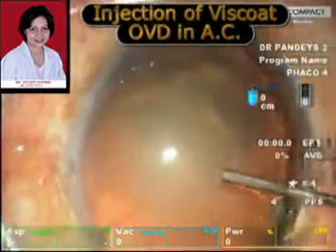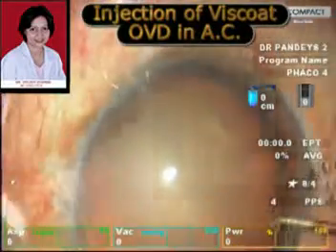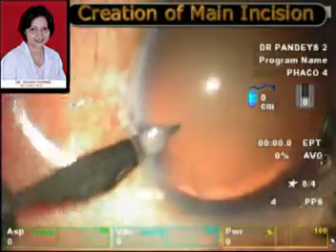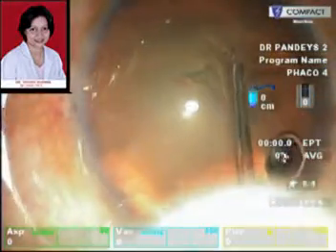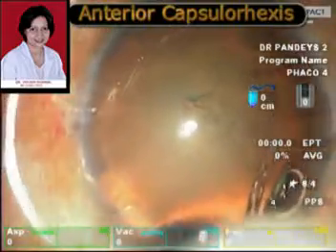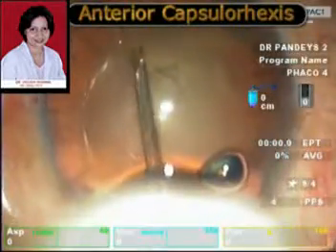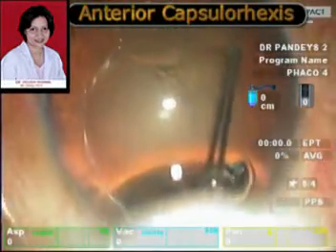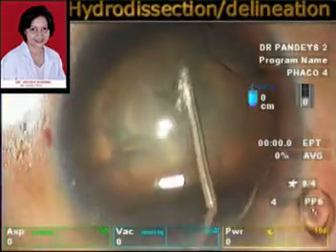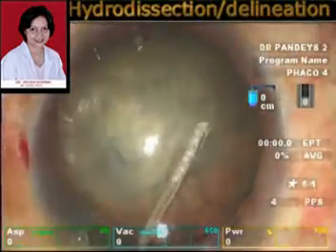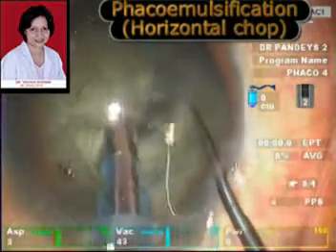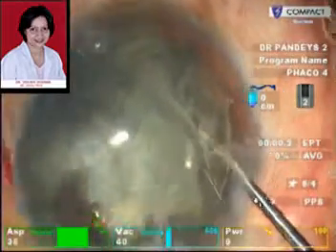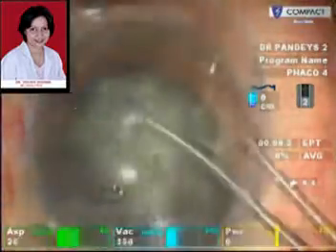Here we are doing the routine phacoemulsification with a side port incision. Viscoat has been injected into the anterior chamber to coat the corneal endothelium and avoid any corneal endothelial damage, especially during the silicone oil removal. An anterior capsular rhexis is then performed, followed by hydrodissection and hydrodelineation. We remove the cataract in a normal fashion, performing a horizontal chop and then aspirating the nucleus fragments.